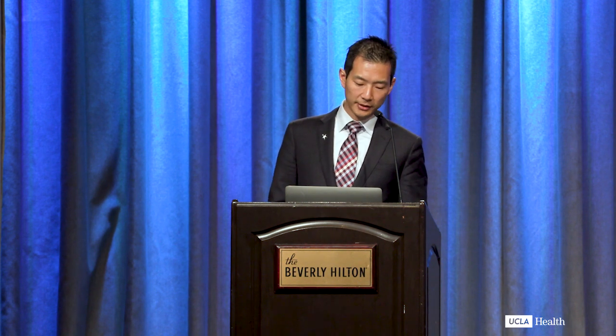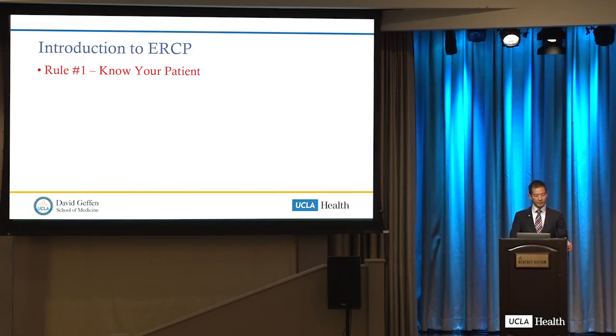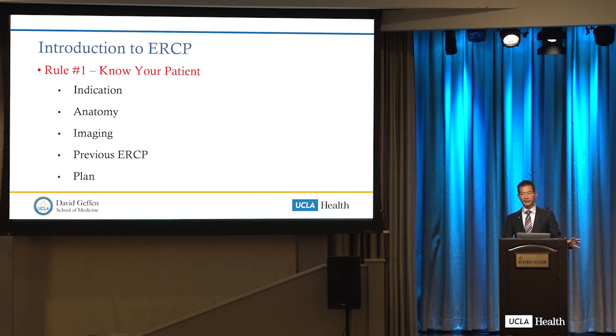These are things I've gleaned from having attended various talks on this topic, particularly as a young attending, when I wanted to see what advice was out there for how to do this procedure properly and efficiently. Rule number 1, know your patient. Seems pretty self-evident. Know the indication for the procedure. Today, ERCP is most often a therapeutic procedure, not a diagnostic one. We have such great cross-sectional imaging now that ERCP is rarely done for diagnostic purposes.